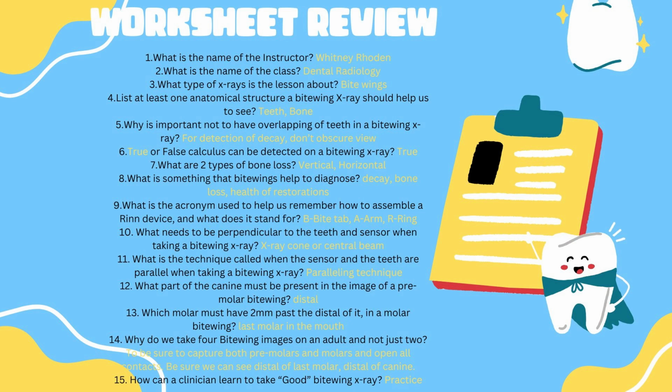All right, last question, number 15. How can a clinician learn to take good bite wing x-rays? Well, practice, of course. Practice makes perfect. Get out there and do it.